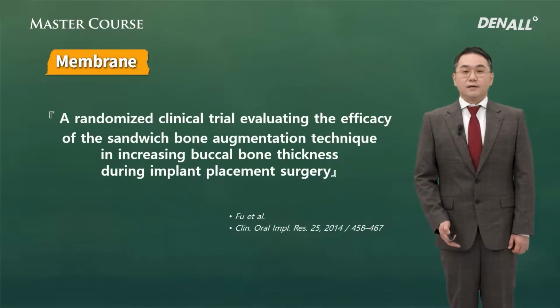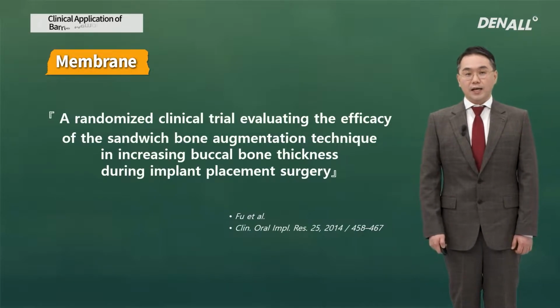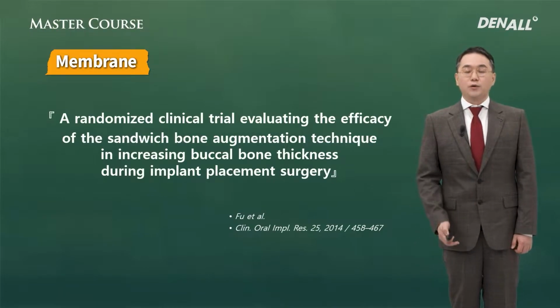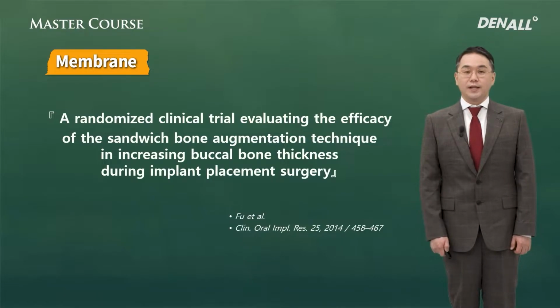Some dentists may think periosteum can be the best membrane. That's right. If periosteum is intact, it can be a good membrane. However, in the environment where we do GBR, we are not sure of the status of periosteum to cover the graft material. This is a study paper on that.